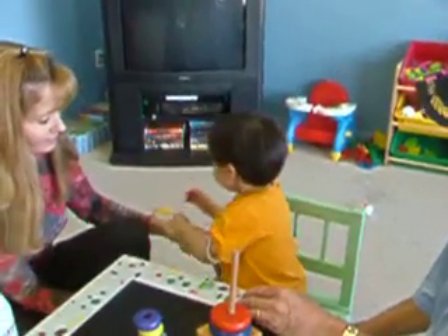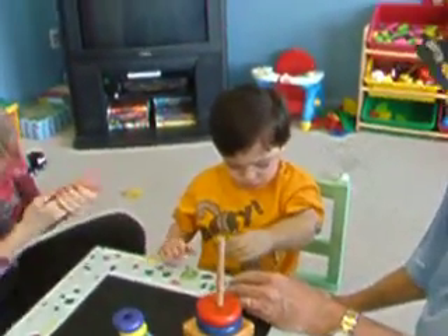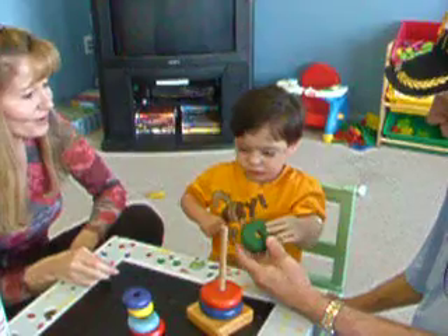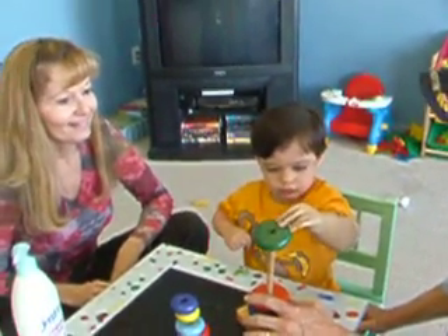No, no. Sit down. Move over behind me a little. Squat. Sit down, buddy. Squat. There you go. Hey, yay, yay, yay. Okay. Good boy. Put it right on there. Good boy.